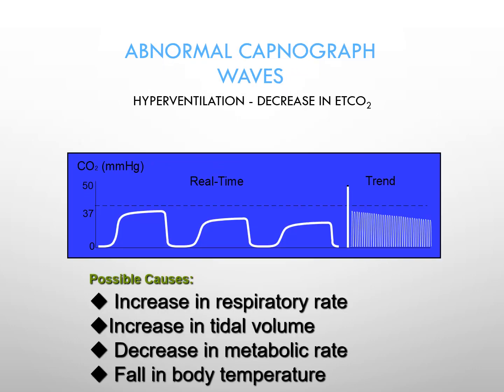And this waveform is showing you the opposite. This capnograph is showing you the opposite of the preceding slide. In the preceding slide, it was gradually rising over time. Again, it's compressed here over 3 breaths, but the inference is that over a period of minutes the prior slide was showing a rise. This particular slide is showing you the opposite, where you have a decrease in end-tidal CO2.